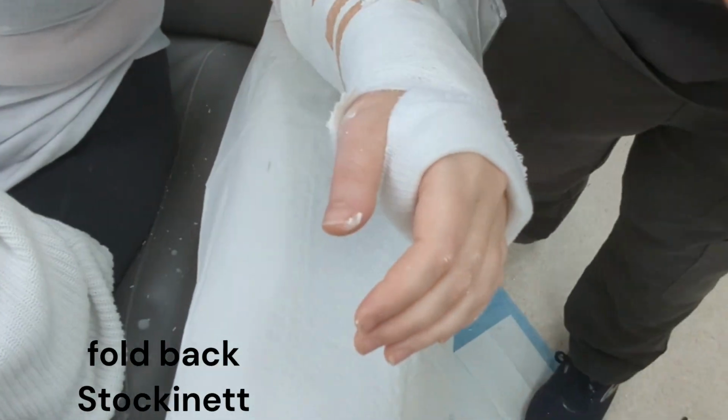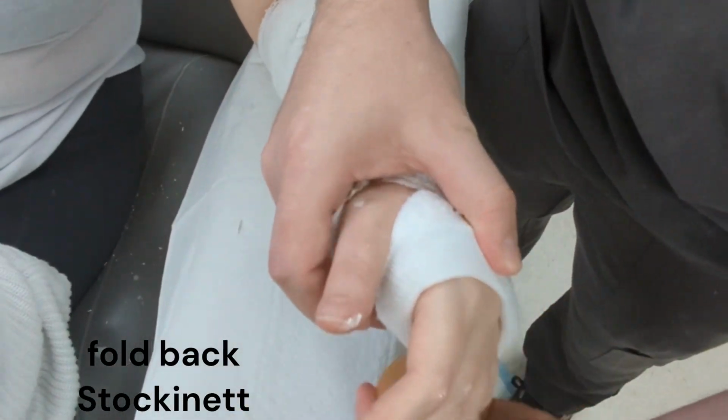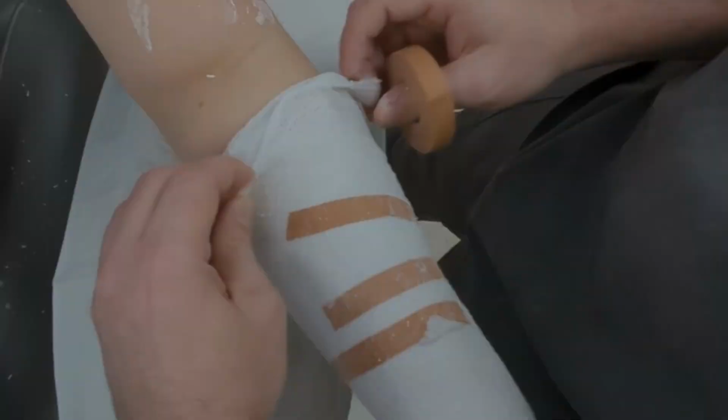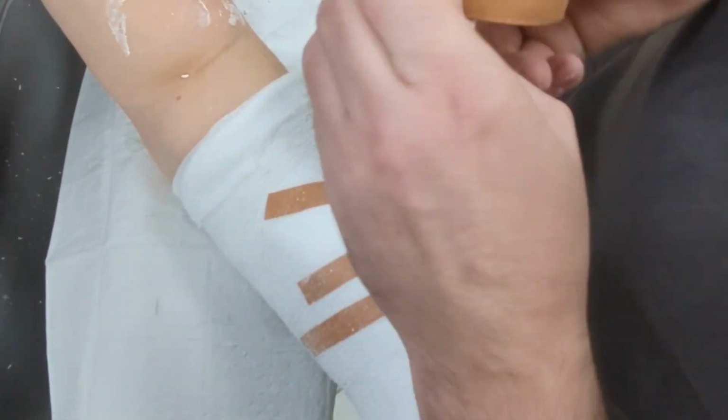It is now time to tidy up the cast. If you fitted a stockinette, you can fold it back and tape it down. This will tidy up the ends and prevent them from fraying.